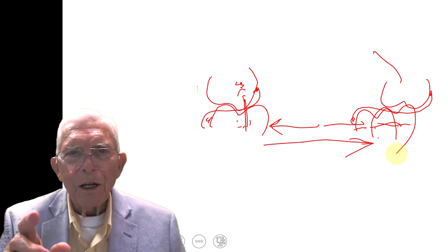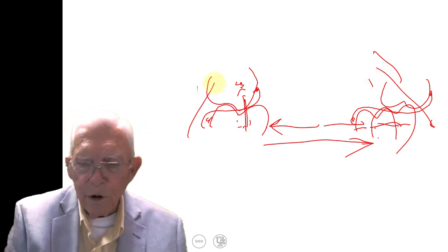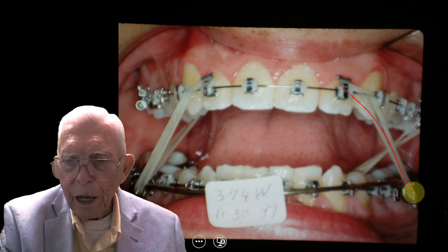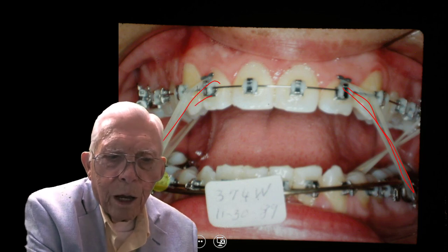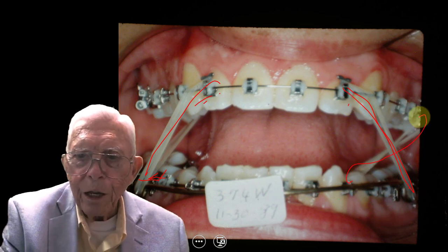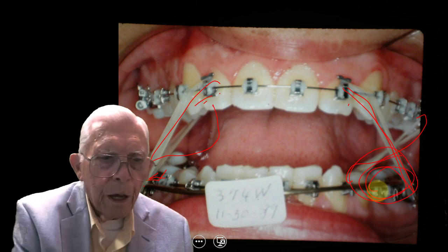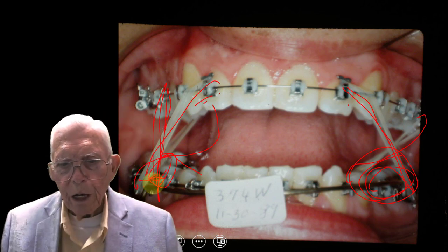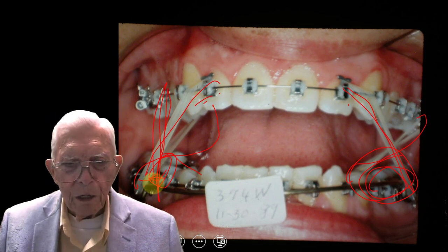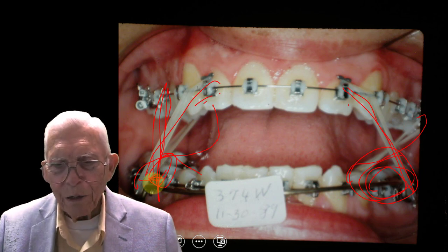Now we had a class two problem, so we were hooking elastics back here bringing these up to the front. These are class two elastics — they're pulling the upper jaw back and the lower jaw forward to correct the class two problem. This movement will take place on the problem side and not disturb the correct side. This is getting pretty complicated, so if you're just tinkering around with orthodontics, don't jump on a case like this to start with. Learn how to do the easy stuff first and then you can expand into something more difficult.